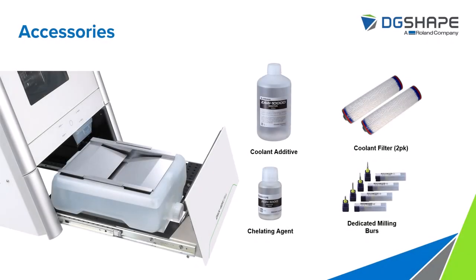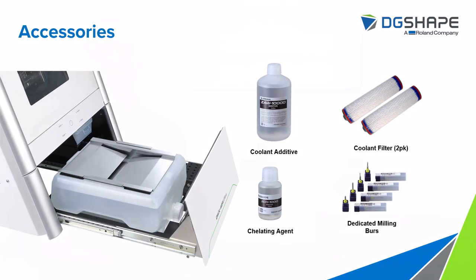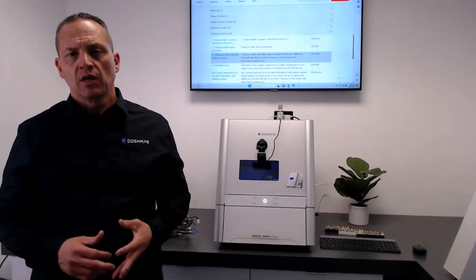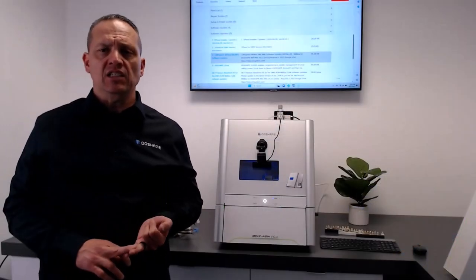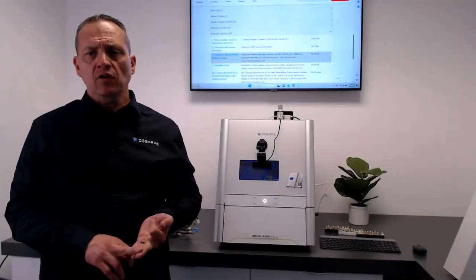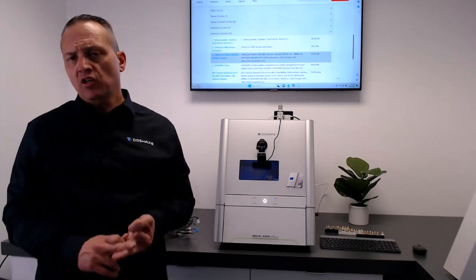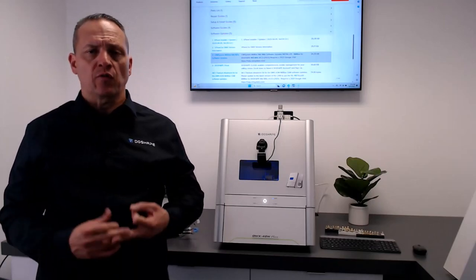And here's a list of some of the accessories you'll need to get your machine up and running. The coolant additive, the chelating agent, the filters, and your dedicated burrs for your specific application.